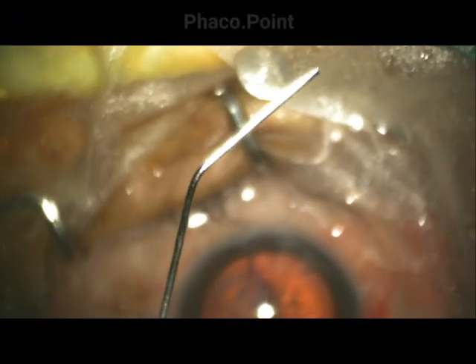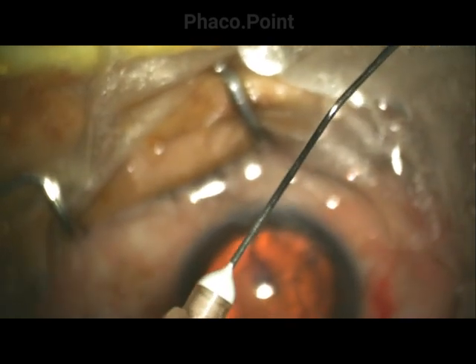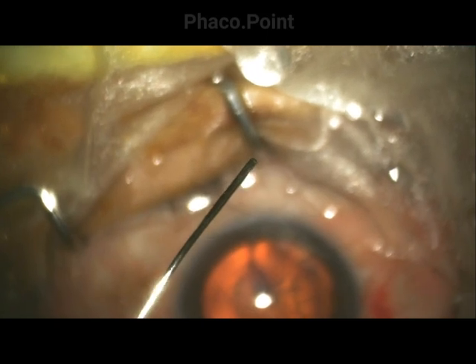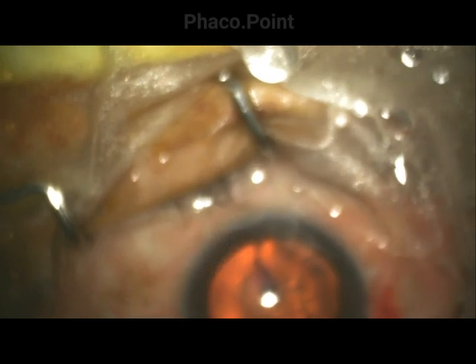The cannula is subject to every surgeon's personal choice. What I use is the Sharp Edge company's 27-gauge cannula, which is flattened at its anterior end. Before performing the hydrodissection, it is important to prime the cannula.